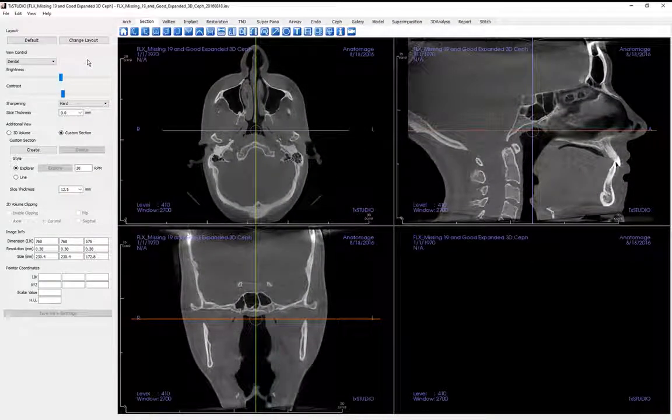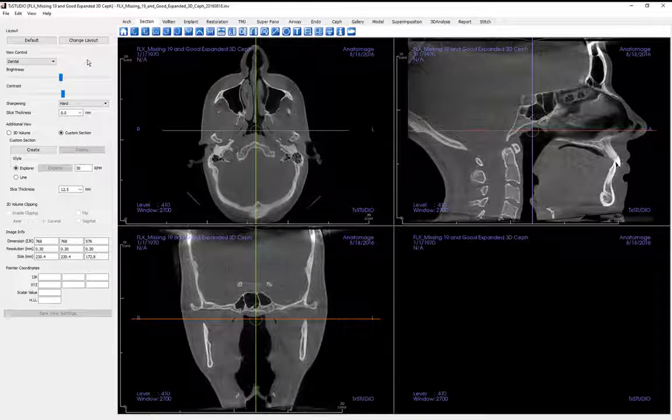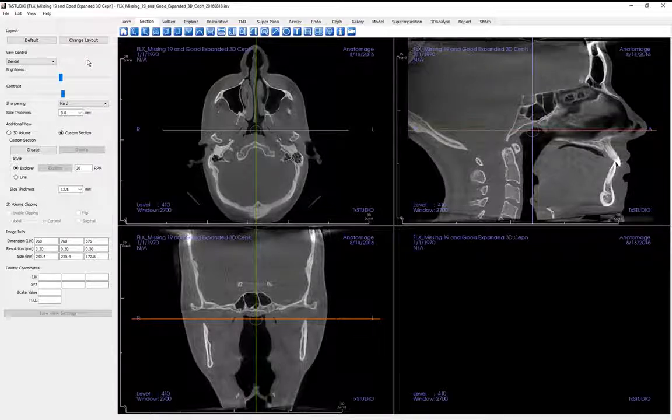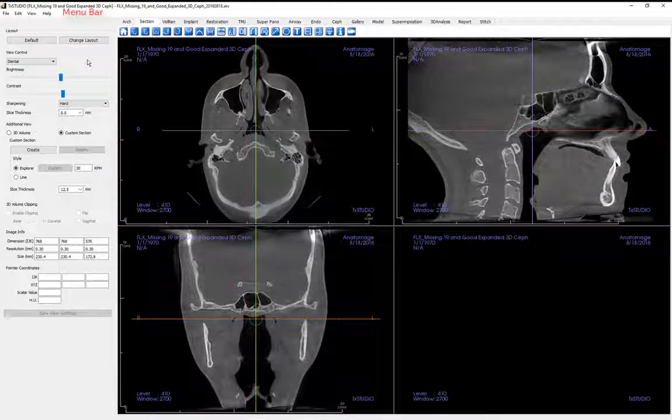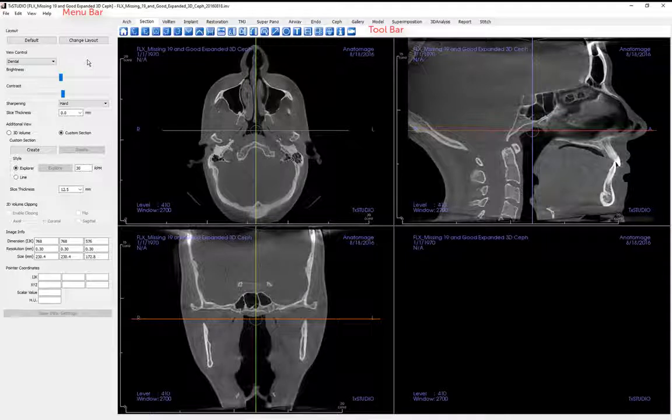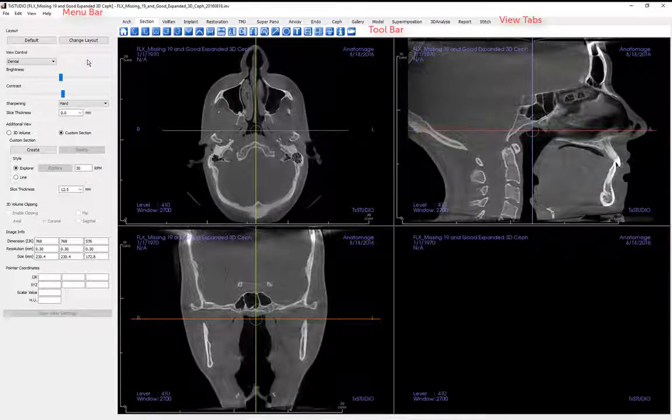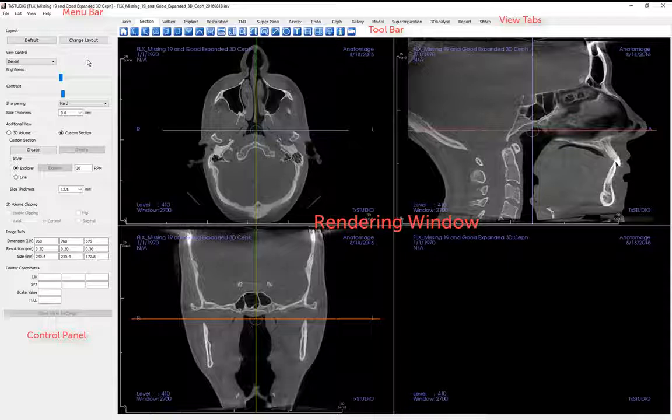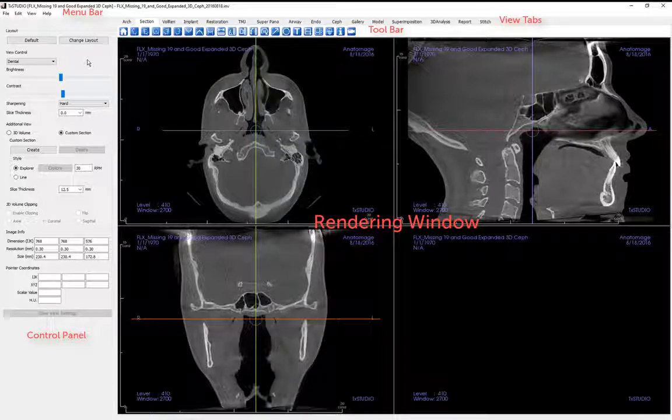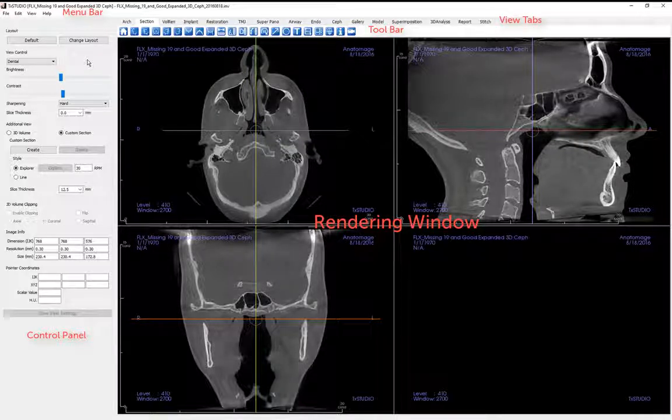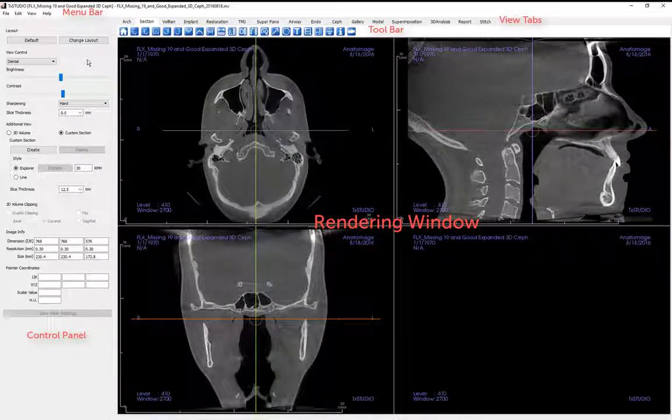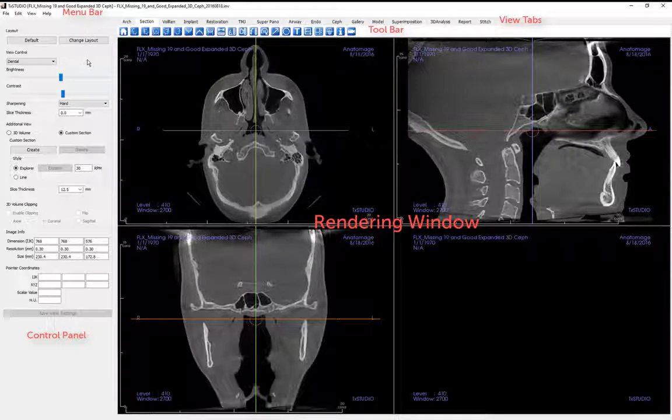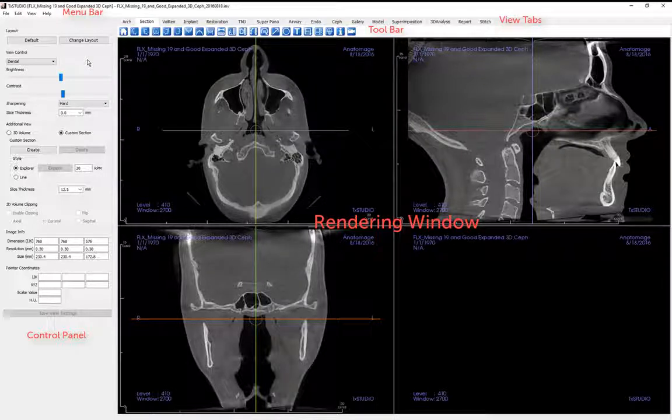The screen layout of the section view, as well as that of the other view tabs, will have a menu bar, toolbar, view tabs, control panel, and a rendering window. All but the menu bar and the view tabs will change depending upon the view tab that is selected. View tabs allow you to perform specific tasks or look at specific areas of interest.